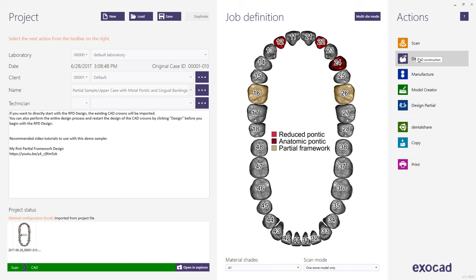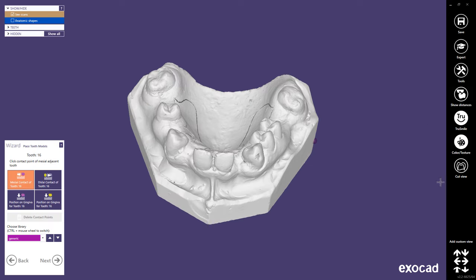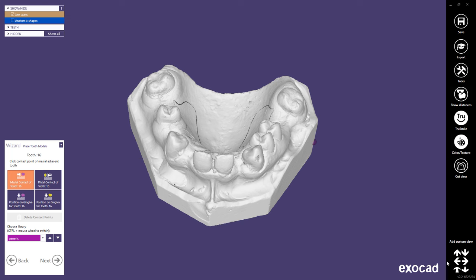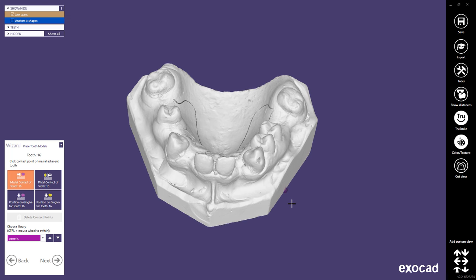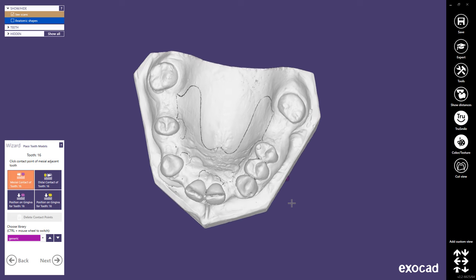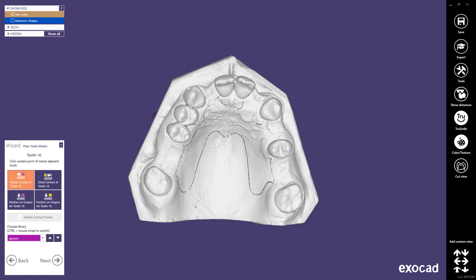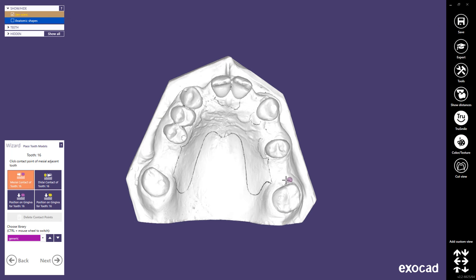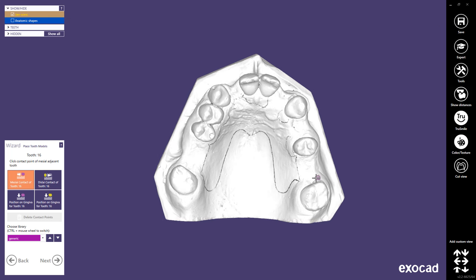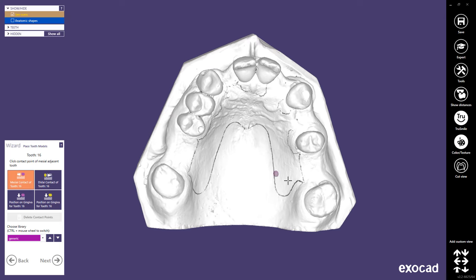If design of individual teeth is not required, you can skip designing in the CAD app and proceed directly to Partial Design. In this tutorial, a 3D mouse is used. If using a standard computer mouse, rotate the model by clicking and holding the right mouse button then moving the mouse. To rotate on a single axis, click and hold the right mouse button on the outer perimeter of the screen. Click and hold both mouse buttons to pan the model. Use the mouse scroll wheel to zoom in and out.